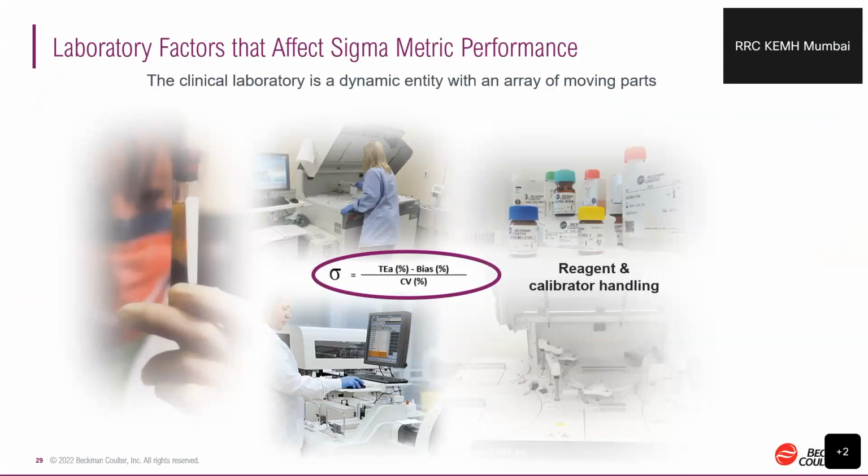Reagents are getting deteriorated and not performing efficiently, and or maybe the reagents have some carryovers. So we'll see in the following slide what the potential interferences are that may be observed in reagents.